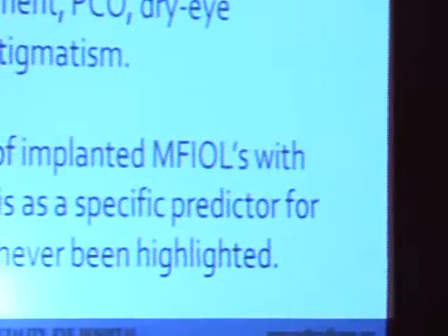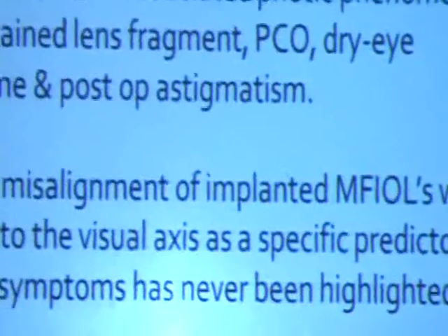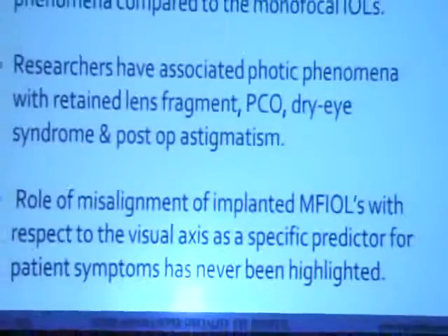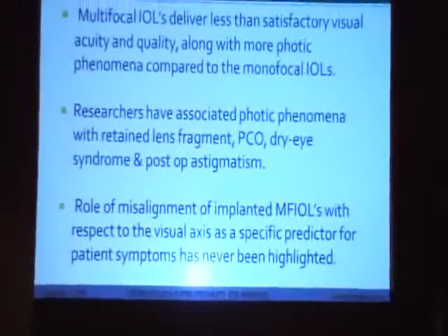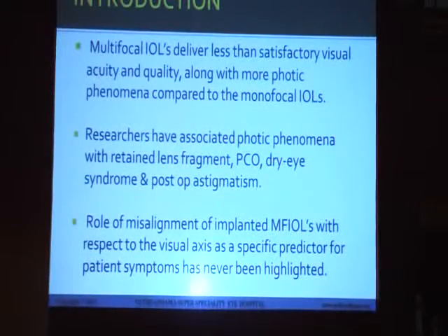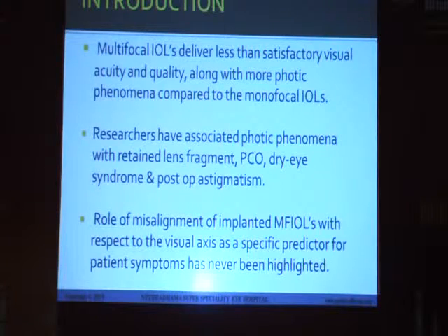Multifocal IOLs, as you all know, deliver less than satisfactory visual acuity and quality along with more photic phenomena compared to the monofocal IOLs. Researchers have associated photic phenomena with retained lens fragment, posterior capsular opacification, dry eye syndrome, and postoperative astigmatism. Role of misalignment of implanted multifocal IOLs with respect to the visual axis as a specific predictor for patient symptoms has never been highlighted.